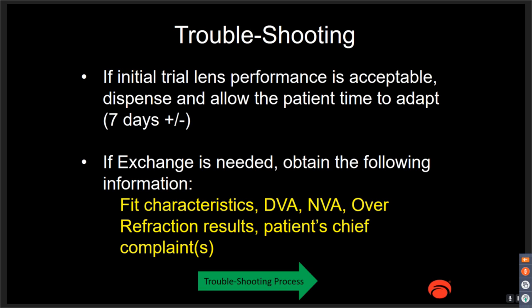If you're throwing in a minus 1.75 right away, you know you're neutralizing the reading portion. So is it a minus 0.50 or plus 0.50 over it? Is it a small amount over it? That makes sense, and that you can alter.